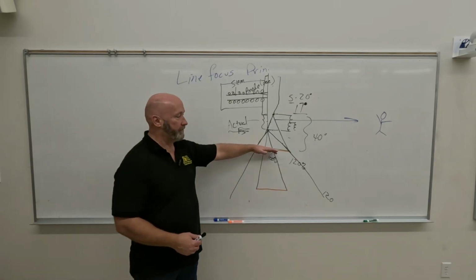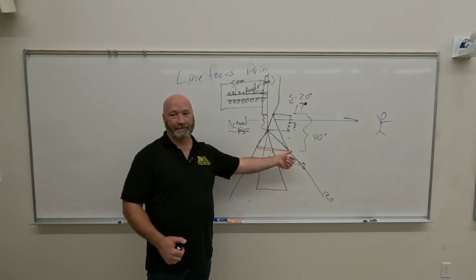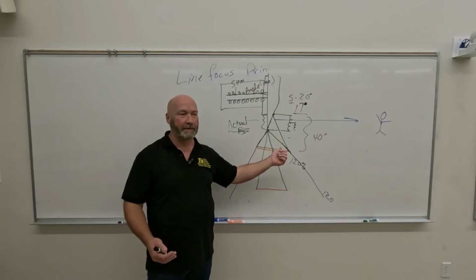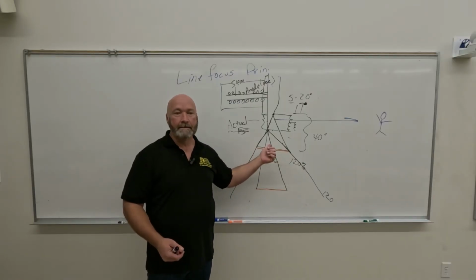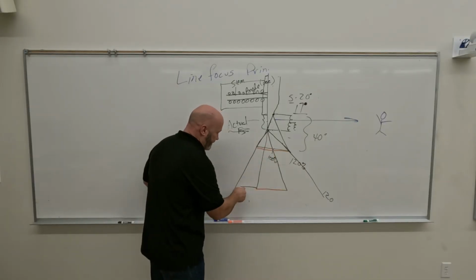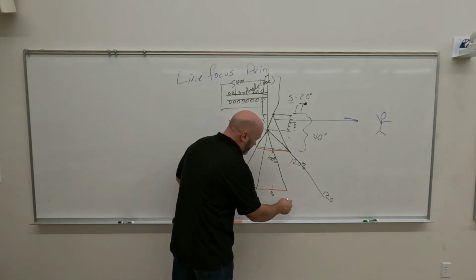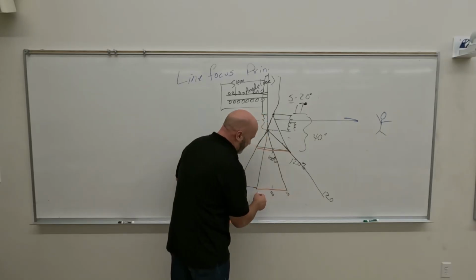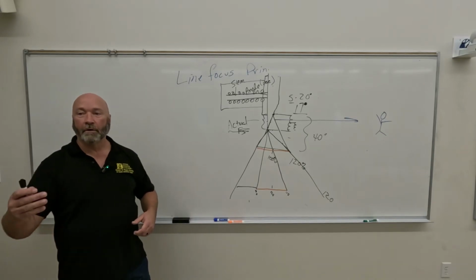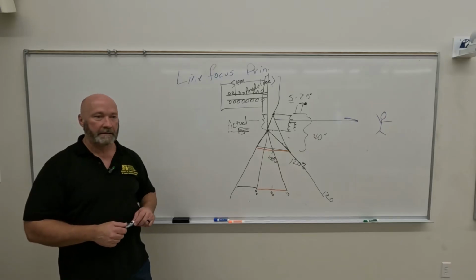How bad is it at 40 inches? Well, it goes from 75 to 120. What swing is that? 55% change between the cathode and anode end of the X-ray tube, or 45% change? 45% change, right? So that 45% change is now down to, if 100% is still here, that may be 110, and this may be 90. Another 20 points. So is it more significant at low SIDs or long SIDs?